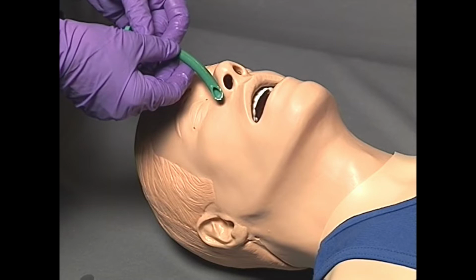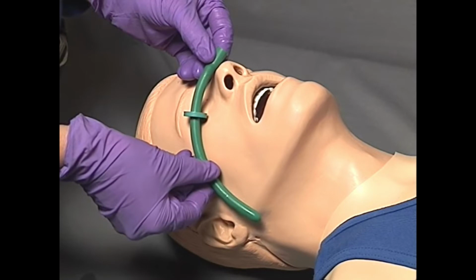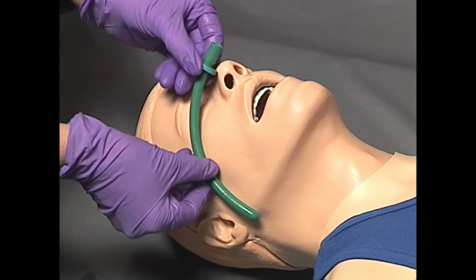Sizing begins by visualizing the patient's nares and then selecting a nasal airway with a diameter slightly smaller than the patient's largest naris. Once the diameter is determined, measure the device from the tip of the patient's nose to the tip of the earlobe or the angle of the jaw. The rubber washer can be slid back or forth on the device to ensure a proper fit for the patient.